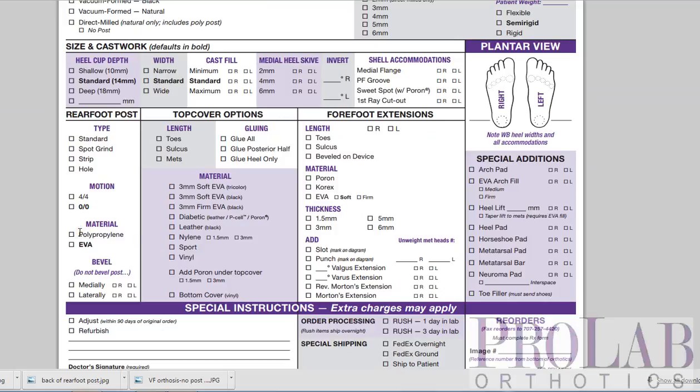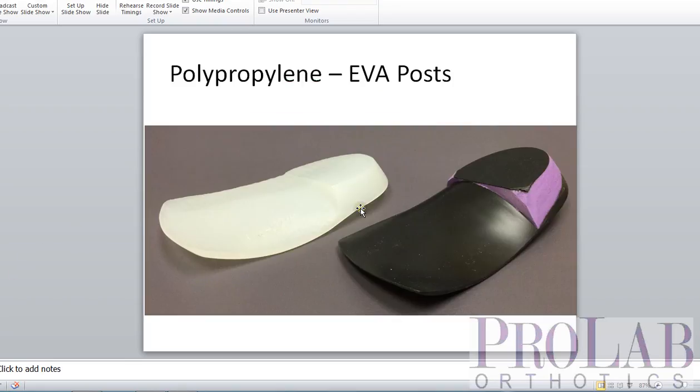Next we look at material choices: we have polypropylene and EVA available. Here's the EVA post — that's the purple portion — and here's a polypropylene post on a direct milled orthotic. Both provide more stability of the orthosis inside the shoe. The advantage of EVA is that it compresses a little bit at heel contact, giving some shock absorption. The disadvantage is that because it compresses, it will eventually wear out, particularly on the lateral aspect. The polypropylene post will not wear out and won't compress, but offers not quite as much shock absorption as EVA.